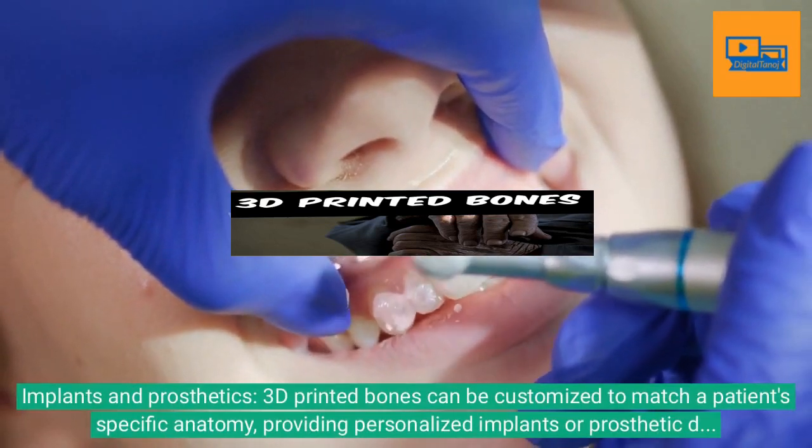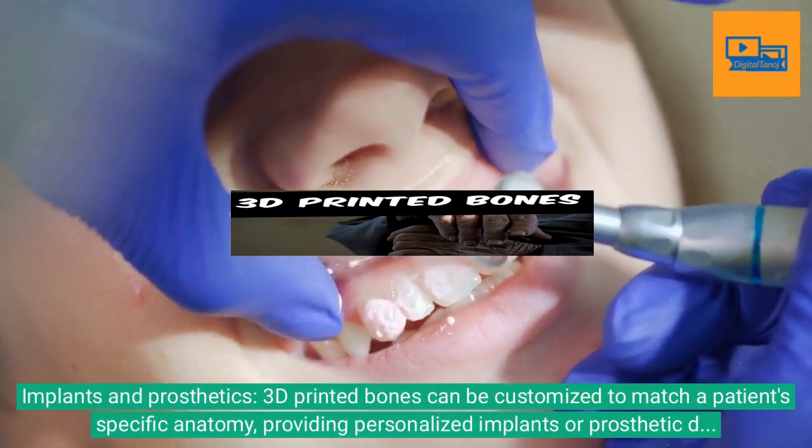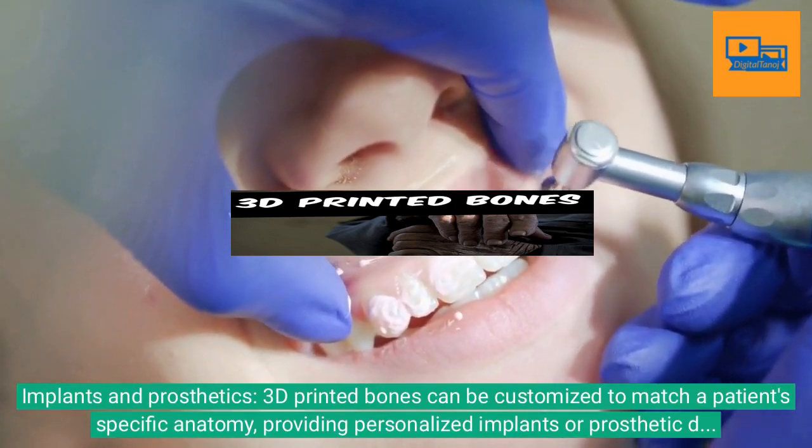Implants and prosthetics. 3D printed bones can be customized to match a patient's specific anatomy, providing personalized implants or prosthetic devices that fit better and promote better integration with the surrounding bone tissue.